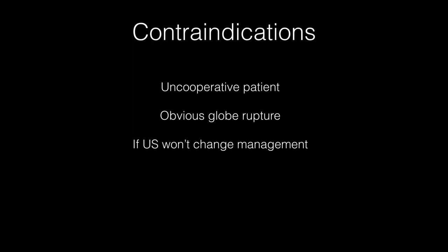So what are your contraindications? First of all, if you have an uncooperative patient, they're not going to be able to sit for an ultrasound. You don't want to potentially harm someone by holding them down. So obviously you don't want to use ultrasound in that situation.